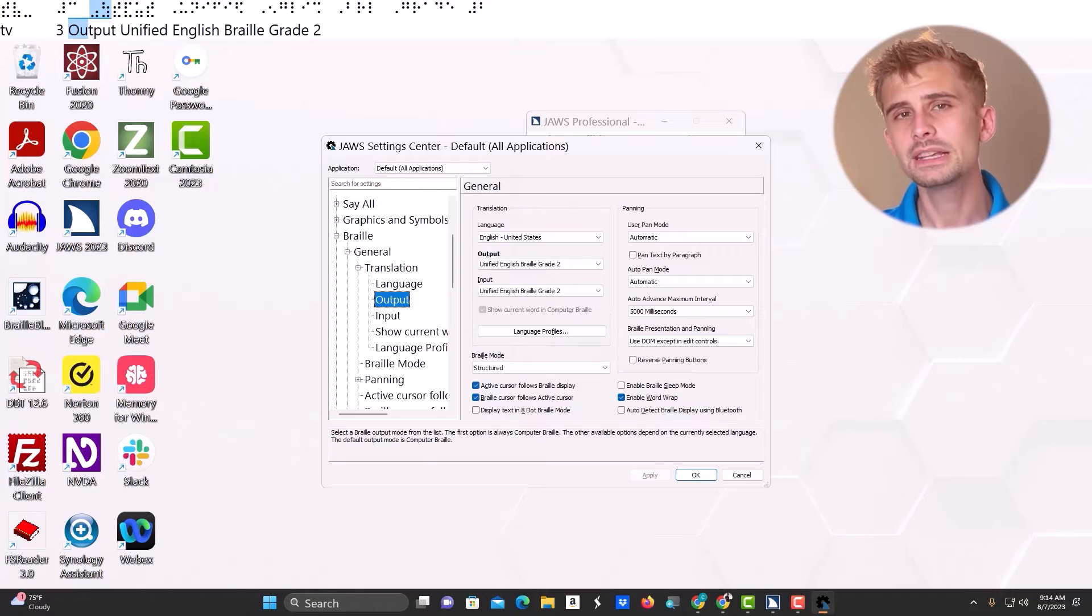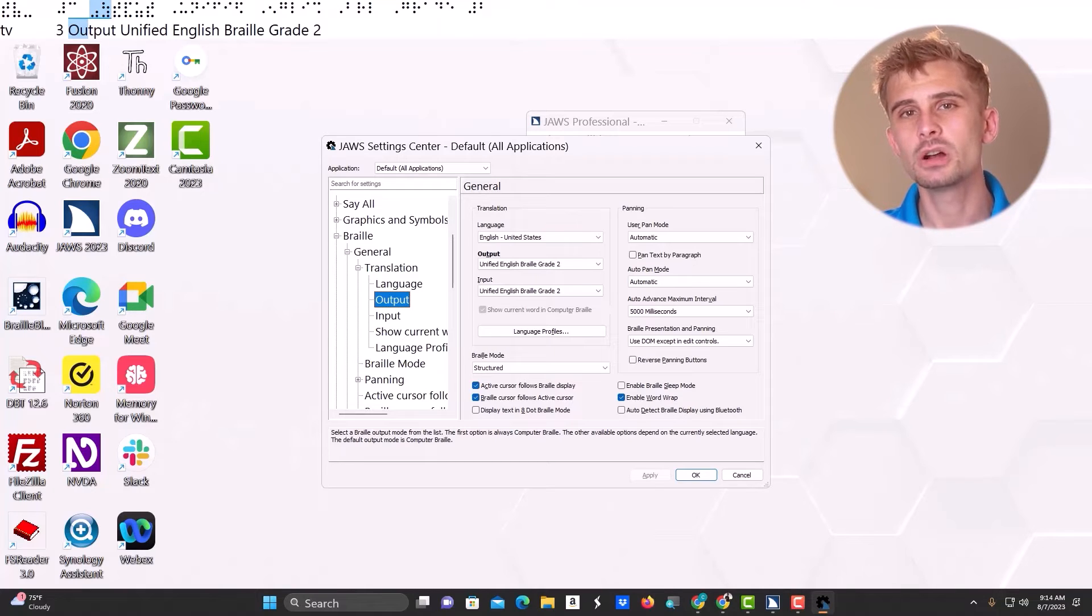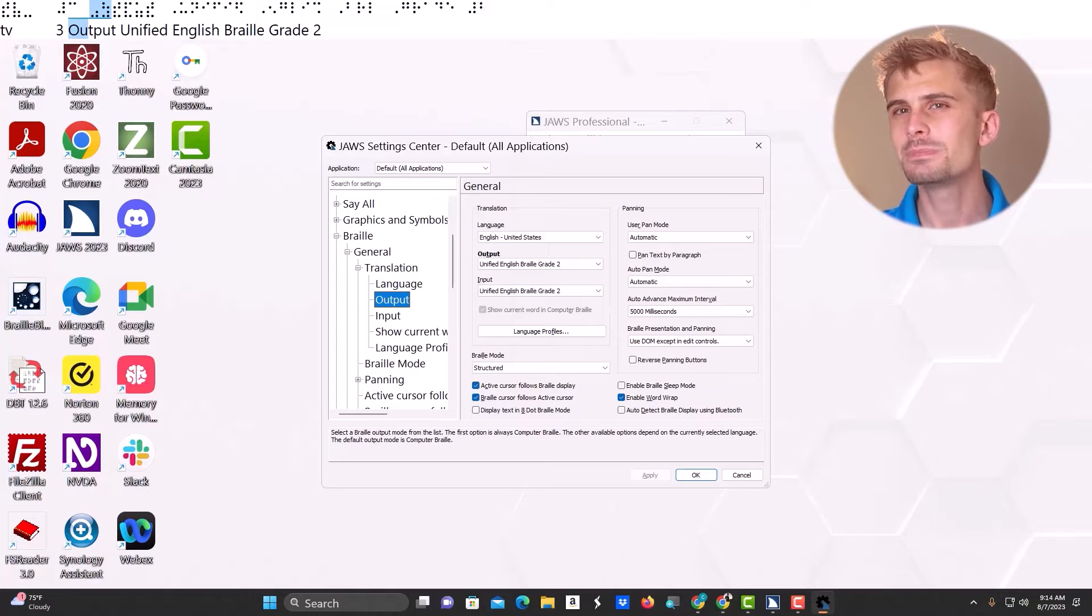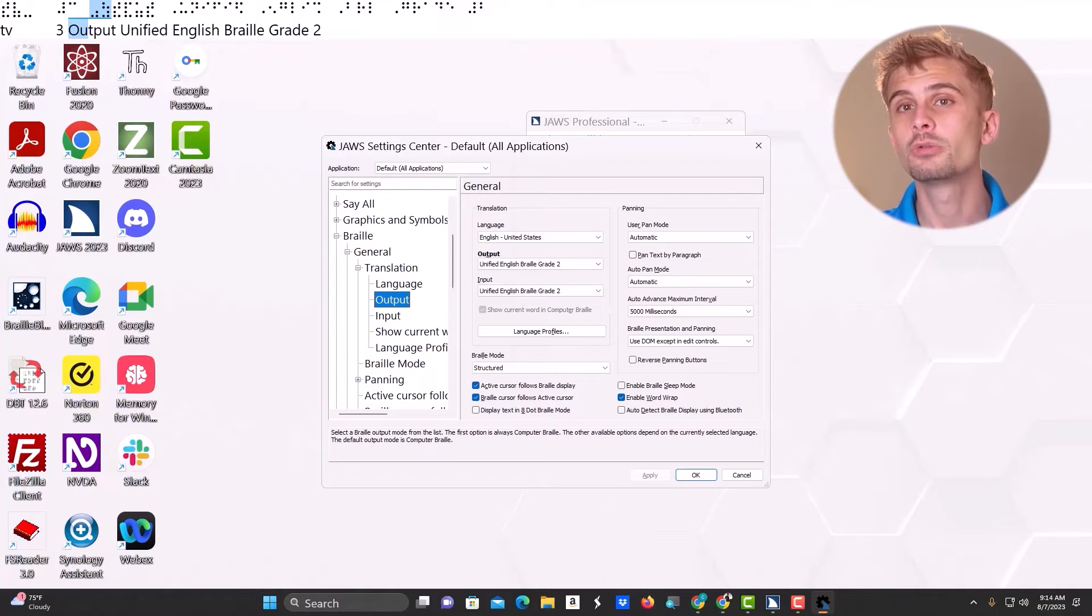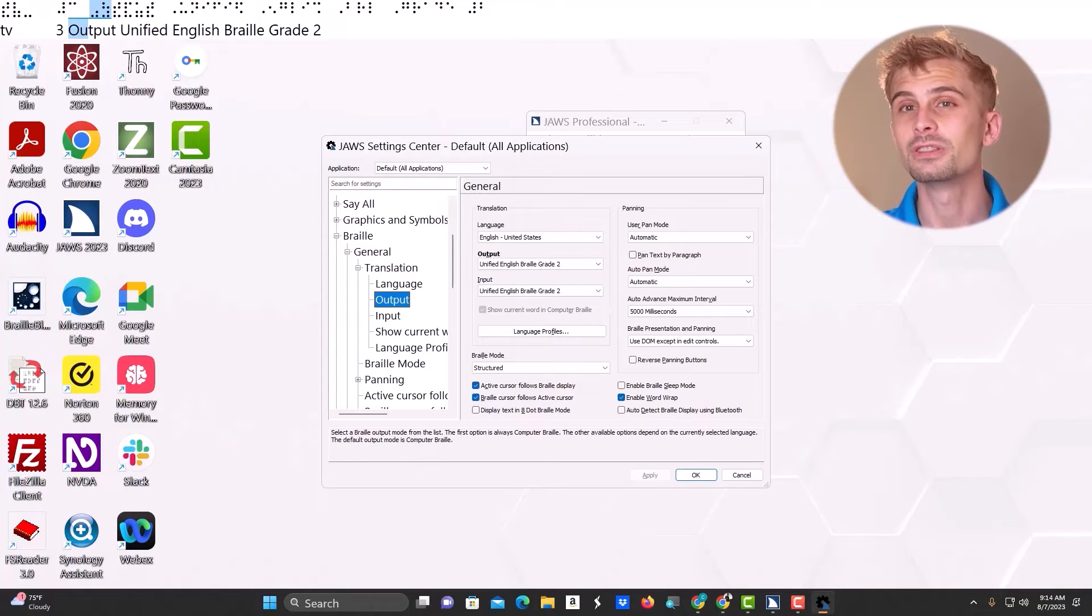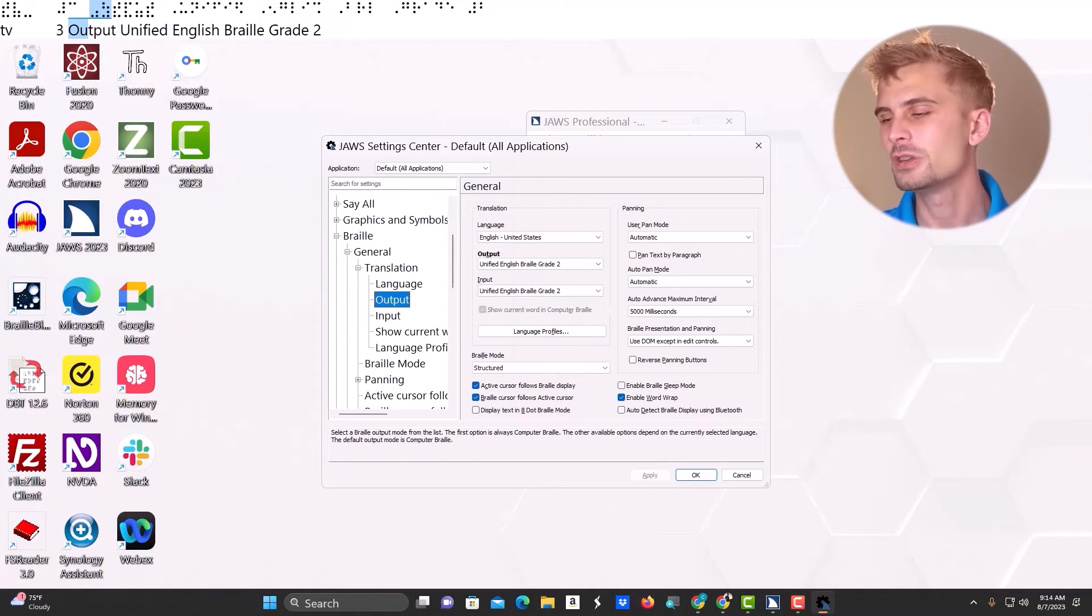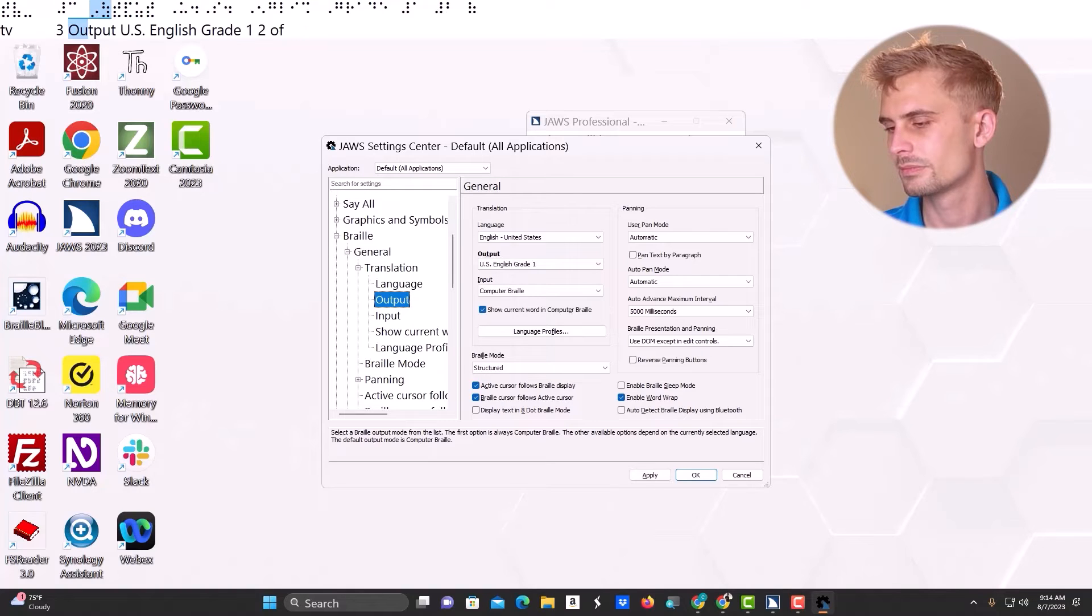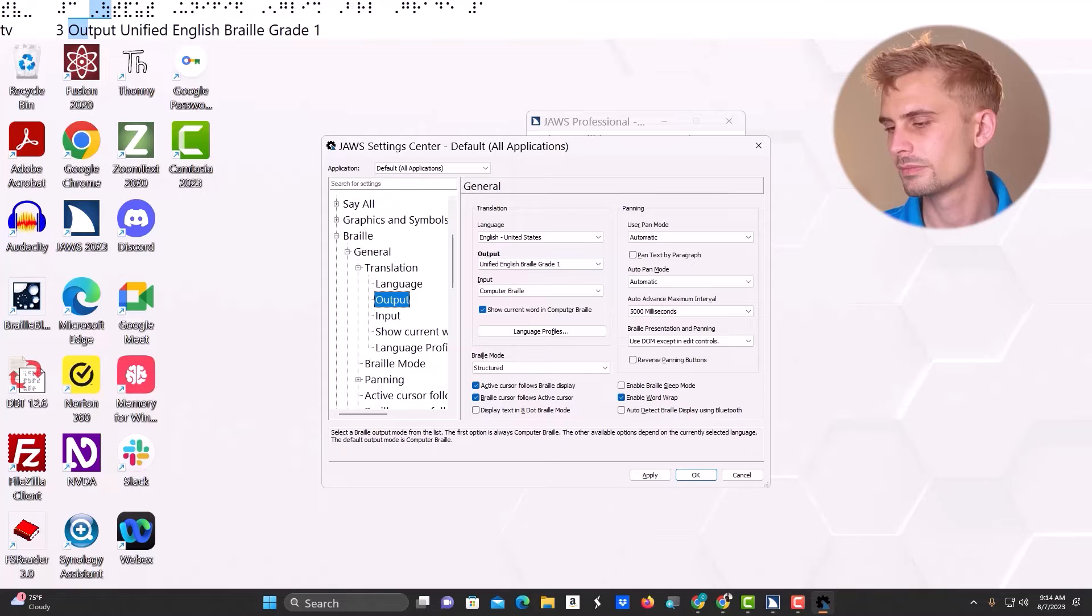I'll change mine to Unified English Braille Grade 1, although you can change yours to whatever suits you or your learner. Let me do it now.